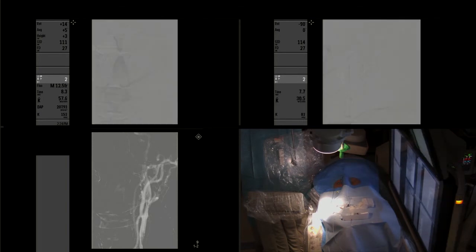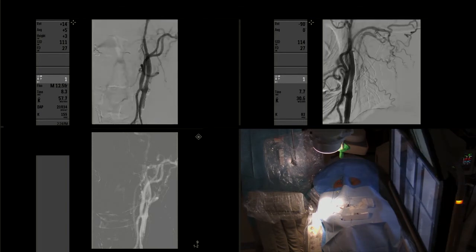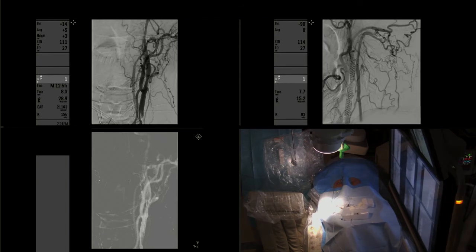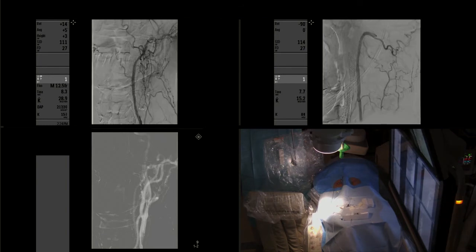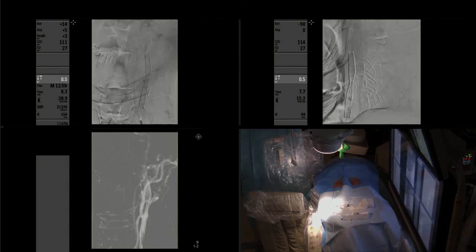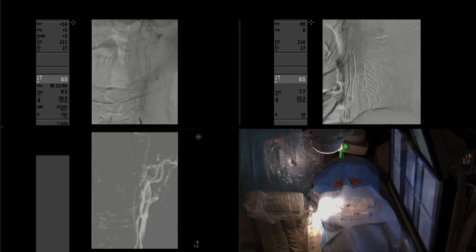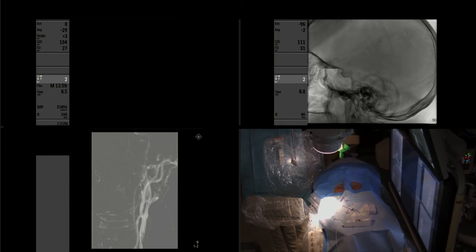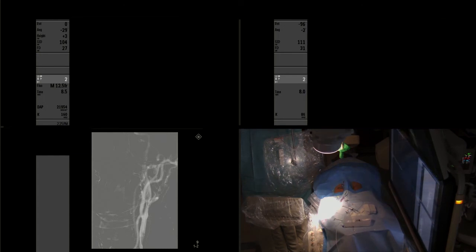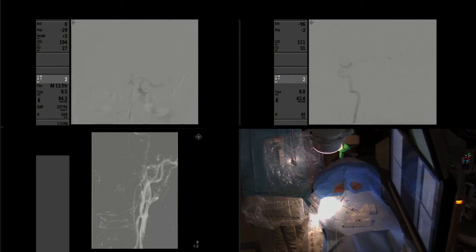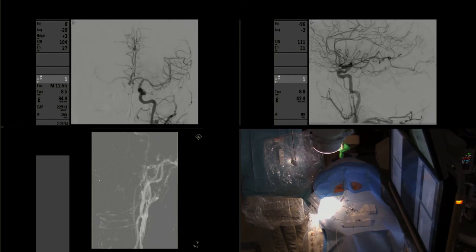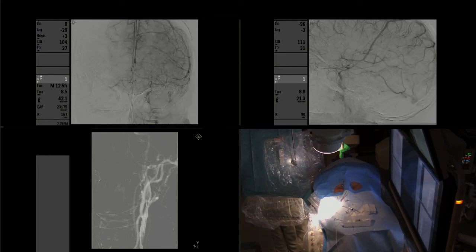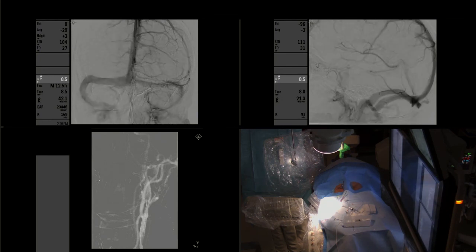This is looking in the cervical segment in which we see a revascularization of the previously severe stenotic carotid artery, and we also look intracranially to make sure that we didn't have any distal thromboembolic complication. You can see a complete even circle of Willis opacification and a successful balloon angioplasty and stenting of the carotid.